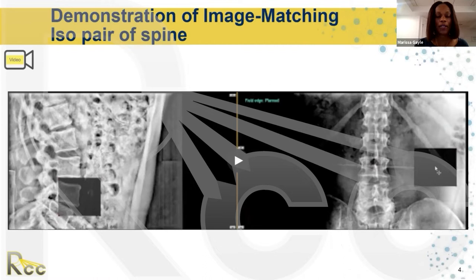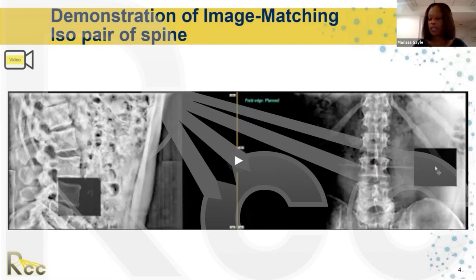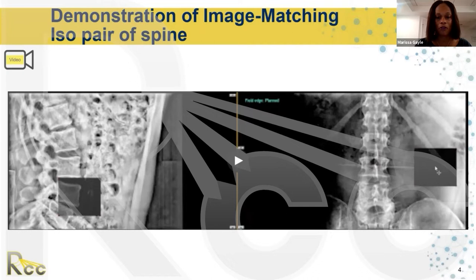The first example we have is a lateral view and an AP view of the lumbar spine. A point of reference I like to start with: whenever you take images, make sure the view is big enough that you can see a lot of different landmarks. On the AP view, we're able to see the iliac crest and the floating rib at T12. On the lateral view, we're able to see each vertebral body pretty clearly, which tells me this is probably a KV image.